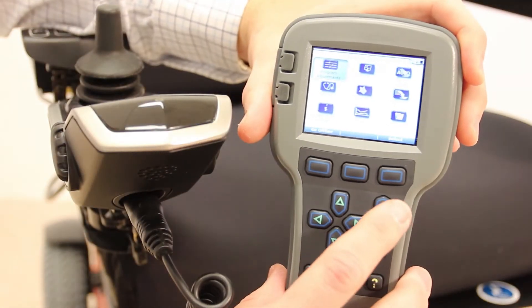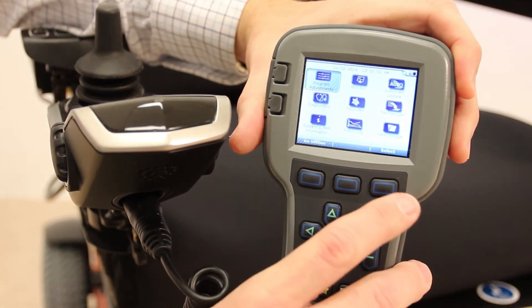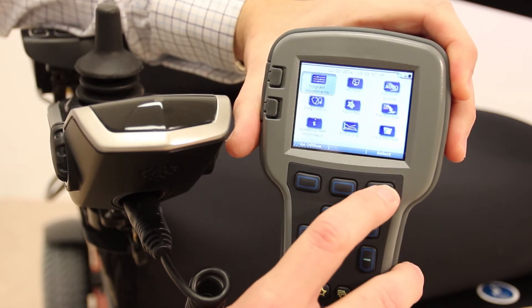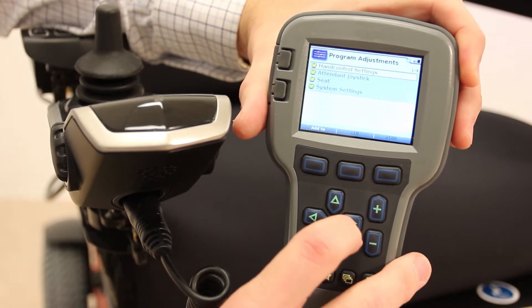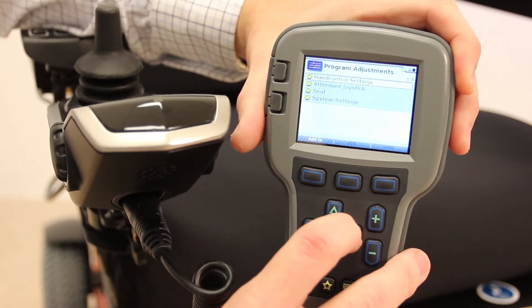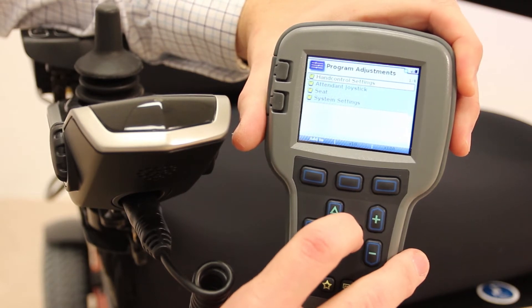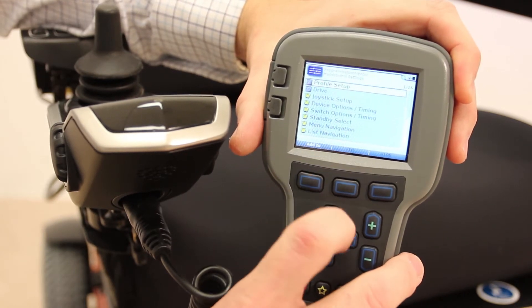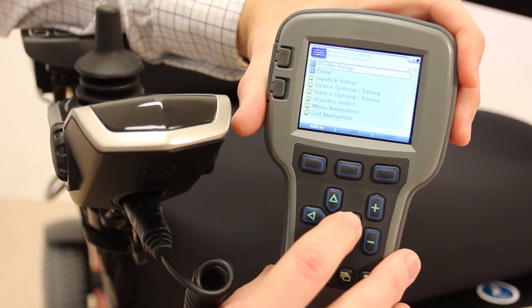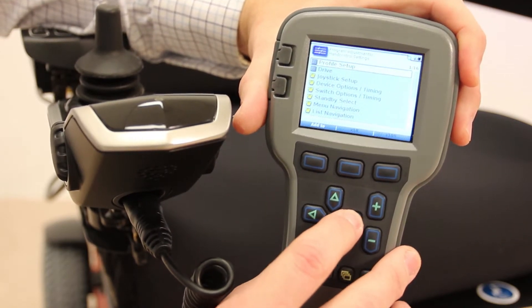The first thing you have to do is make sure that program adjustments is highlighted and hit your soft key that says select above it. We're going to be programming the hand control, so we want to give a right command to go into the hand control settings. We want to change a profile, so we're going to utilize profile setup — give a right command to enter profile setup.